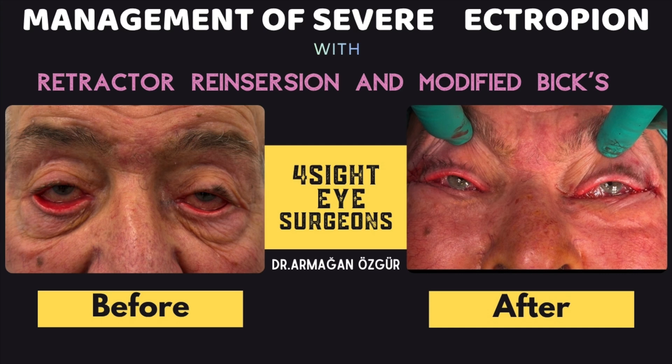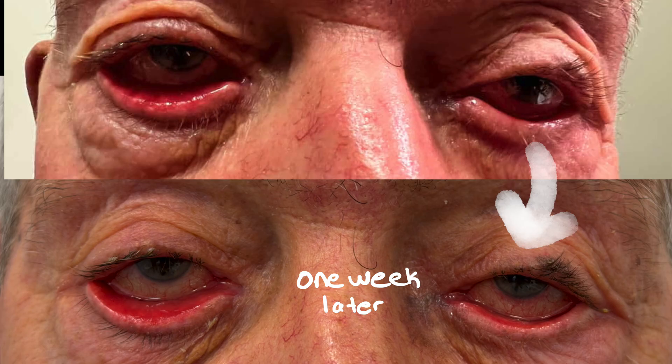This video demonstrates a transconjunctival retractor reinsertion combined with BICS procedure for the surgical correction of involutional ectropion. This patient was referred to me by one of my esteemed colleagues for surgical treatment. A week later, the patient contacted me, and even during that short period, I noticed that his left eye had worsened.